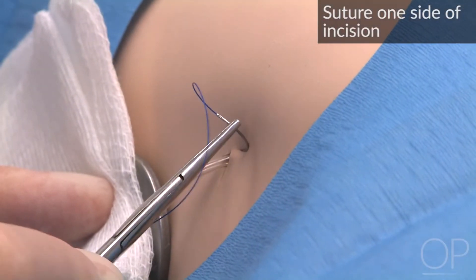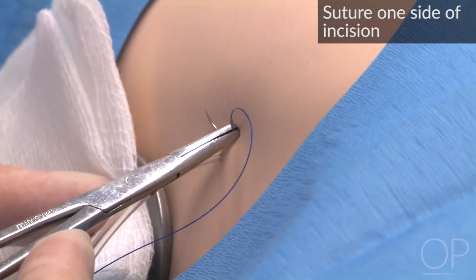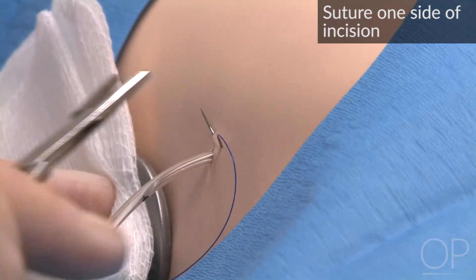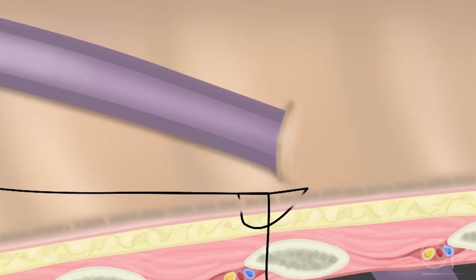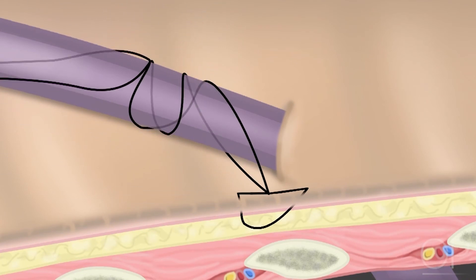Suture one side of the incision. Wrap and tie the free end of the suture around the chest tube.